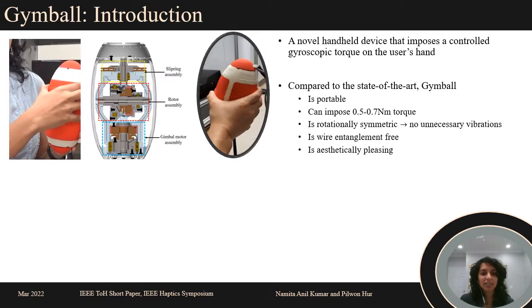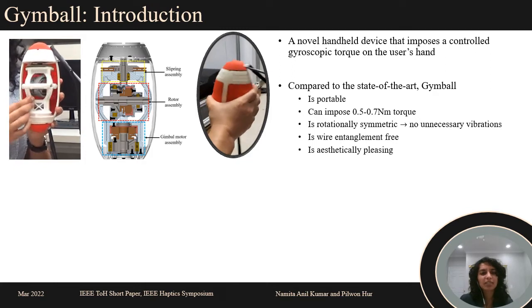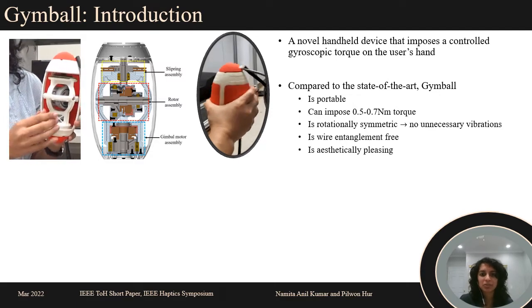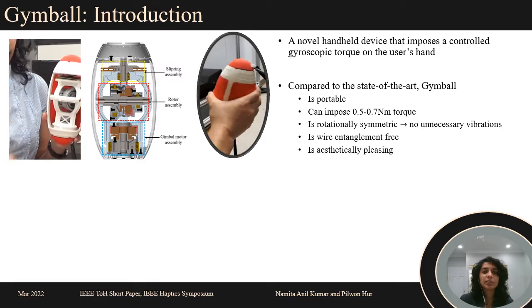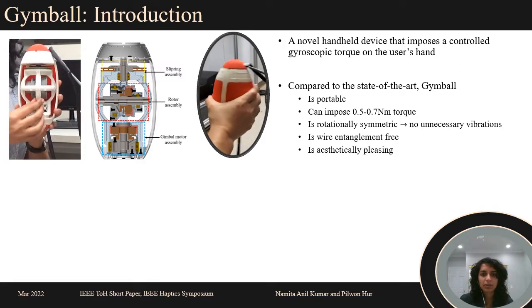Our device called Jimball is a novel handheld gyroscopic device that imposes a controlled gyroscopic torque about the user's wrist. It consists of an actuated rotor and gimbal housed in an easy-to-grip shell. Compared to existing devices, Jimball is portable and can impose about 0.5 to 0.7 Nm torque about the wrist.